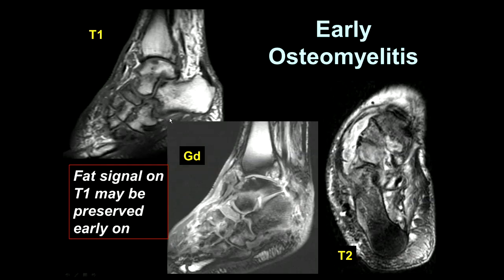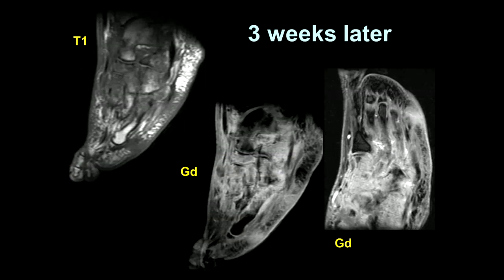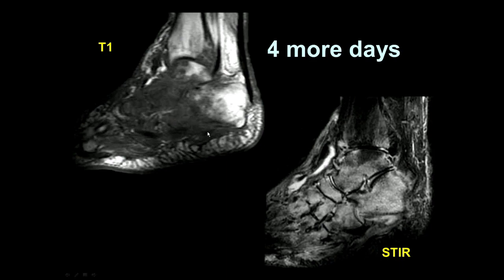Early osteomyelitis is another important concept. We've been taught that the T1 marrow signal is replaced in the setting of osteomyelitis, but that's not necessarily true in early infections. The fat takes time to metabolize inside the bone, so if you catch an infection very early on, the fat signal may not be completely replaced yet. We see an area of edema at the hind foot and mid foot, enhancement, but the T1 signal is not completely replaced. This patient was not a surgical candidate and was treated medically and followed up. Three weeks later, we're starting to get replacement of the T1 signal completely, more compatible with osteomyelitis. Four days after that, you can see classic osteomyelitis with involvement of the mid foot and hind foot.